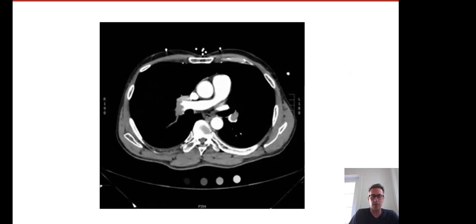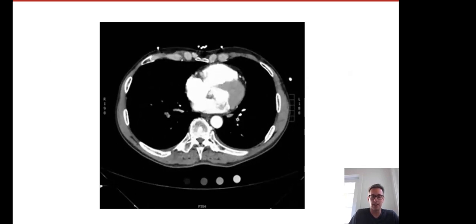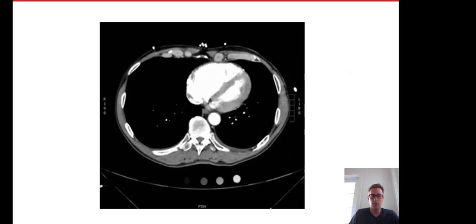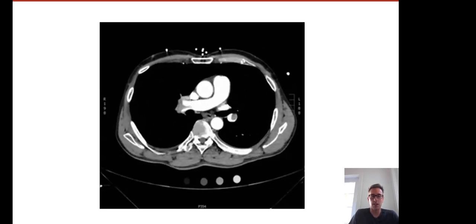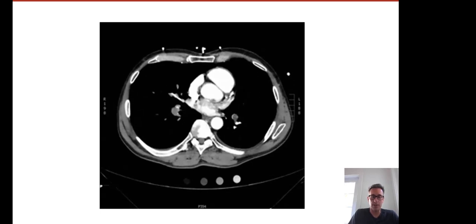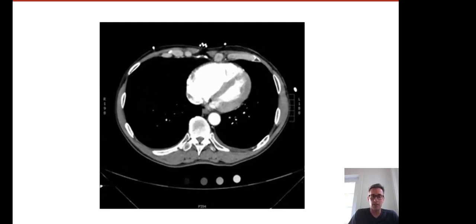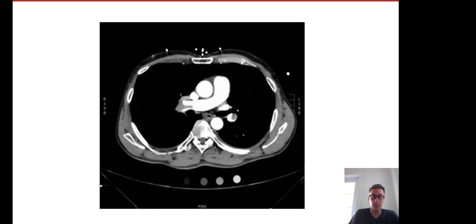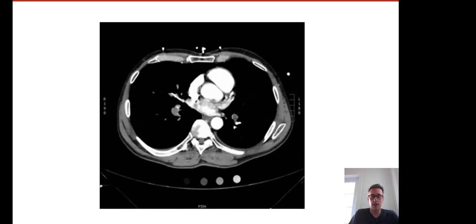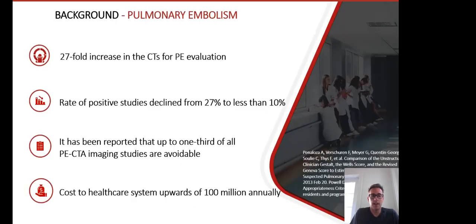So here's an example of a 3D imaging exam, a multi-slice CT of the chest, which was performed to evaluate for pulmonary embolism, which is a dangerous condition that is often very important to identify. And there are many solutions on the current market even for this problem, for automatic identification using the pixel data to identify this condition. And it's an important problem to try to solve.